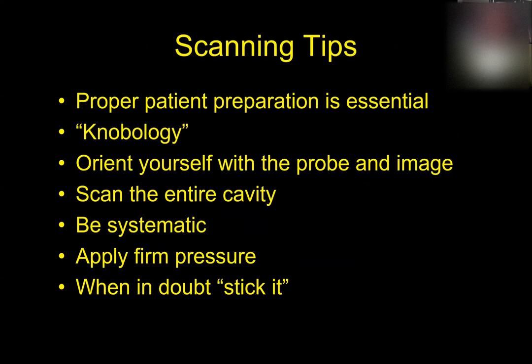Okay, scanning tips. Dr. Warner probably reviewed some of this with y'all before. Proper patient preparation, it's hard to say if you say that fast, is essential. And by that, I mean, when you get ready to do an ultrasound, you have to clip the hair on the surface of the animal, the cavity that you're getting ready to do, and you have to clip it like you're going to go to surgery. So basically, you clip the entire hair where there's no hair left, and you have to do a fairly decent job of it. If you try to do an ultrasound when the animal has hair on it, even a stubble or something like that, it's going to greatly hinder the image quality that you will see, which again will cause you to make wrong diagnoses and misdiagnoses.